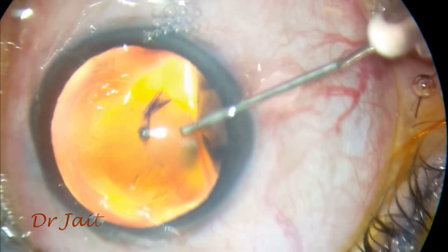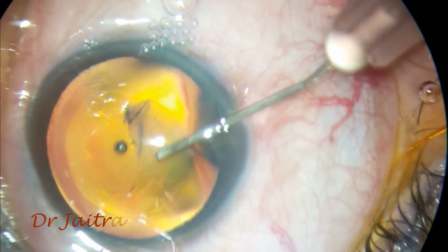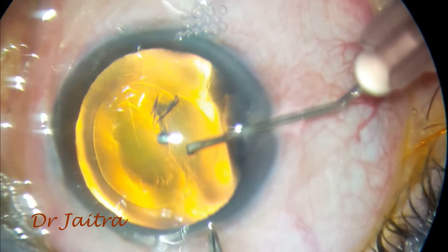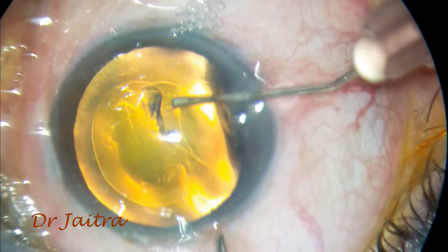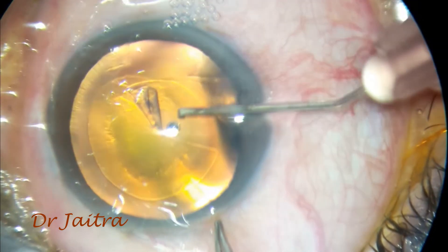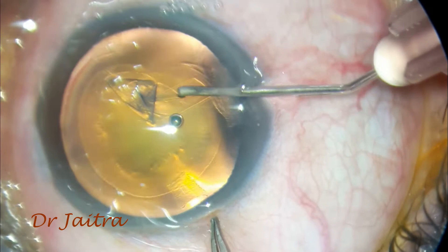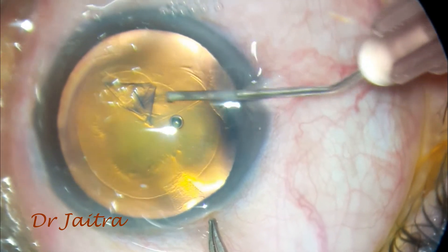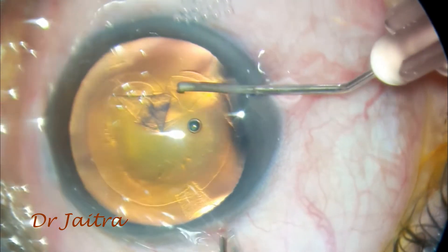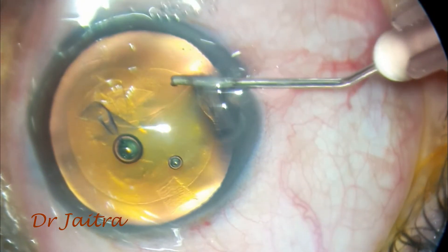I do the rhexis from the main port anti-clockwise. Whenever I feel that the anterior chamber is becoming shallow, I can just inject visco through the same needle without taking the instrument out of the eyeball. Always make sure the anterior chamber is nicely inflated with viscoelastics, and the free rhexis flap is kept away from the incision.